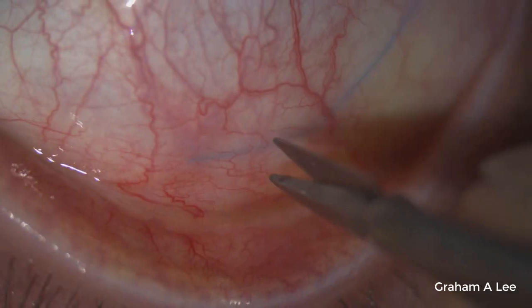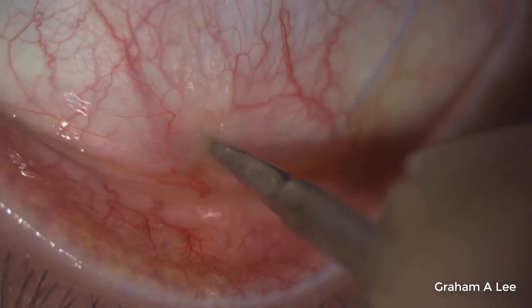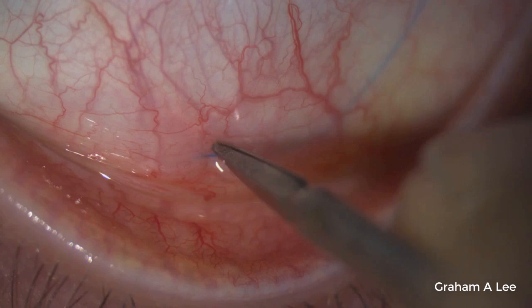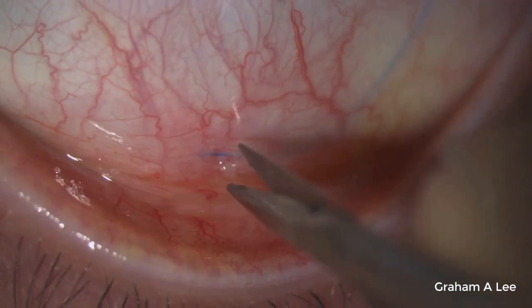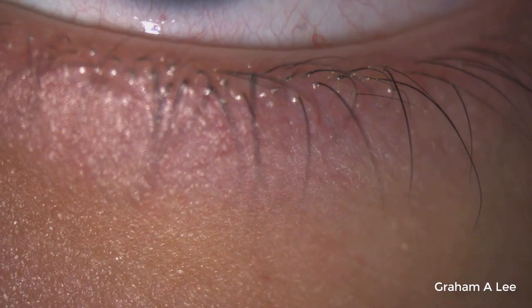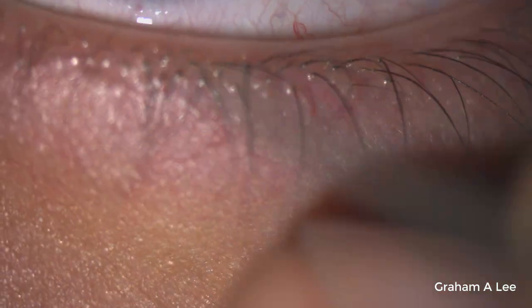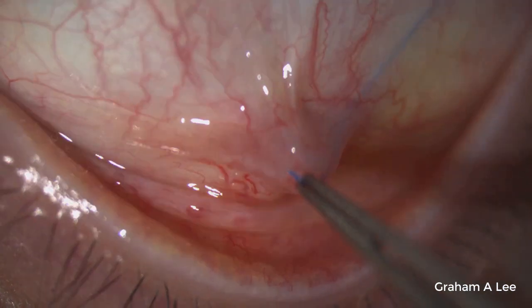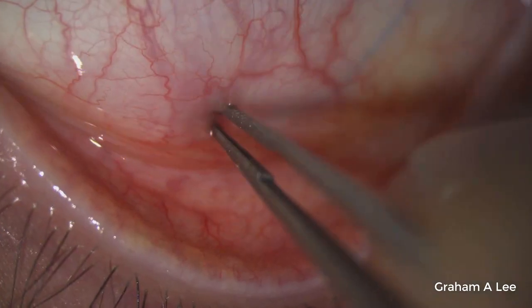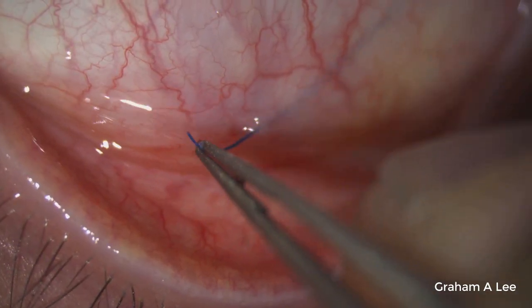This is actually skipping ahead to post-op, and this is a young fellow who had uveitis, and this is actually 18 months post-tube insertion, and this is removing the 6-0 Prolene. So you can see I usually put the Prolene into the inferior fornix. I have a fine 2 forceps here, and this is quite good at removing the suture. Now, you can imagine this has been in there for 18 months.